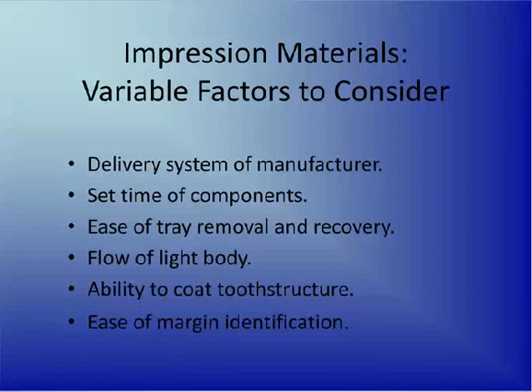So let's take a look at some of the various types of impression materials and delivery systems which we can evaluate as clinicians. There's a lot of companies out there producing impression materials. Some are inexpensive and maybe don't offer you too high quality, and then some are high quality. We're going to talk about some of the high quality materials that we have available in the marketplace, and I'll try to home in on what I use as an everyday clinical procedure.